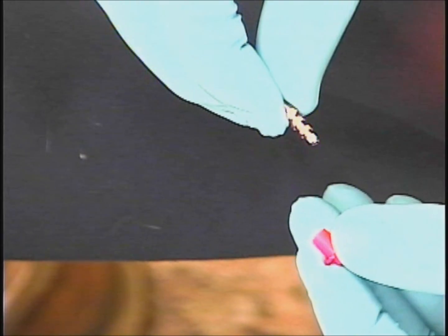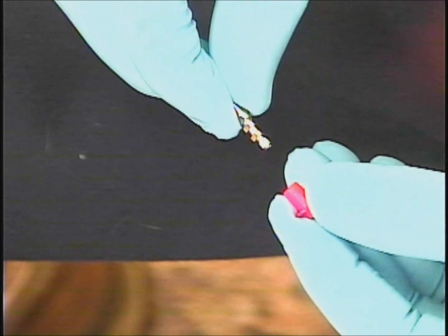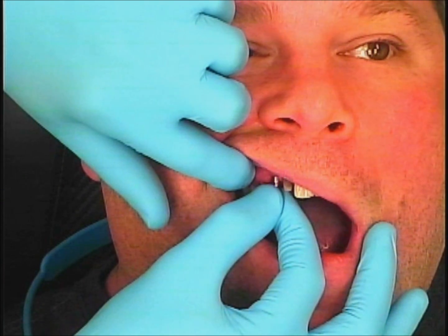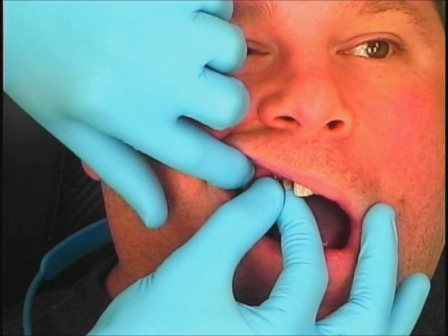I'll be showcasing the NEOS implant system, and here you can see I have my retentive element and pin, and there's a red cap that's going to be snapped on top and that gets picked up with the impression.